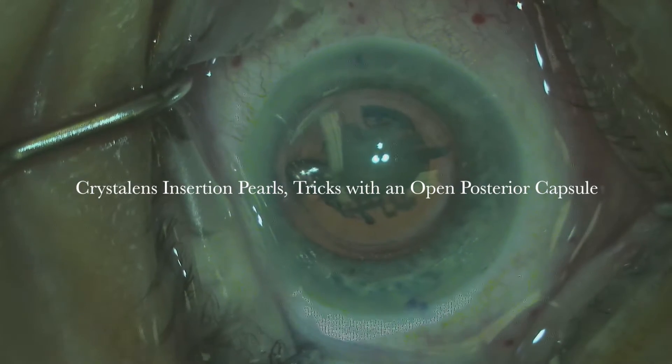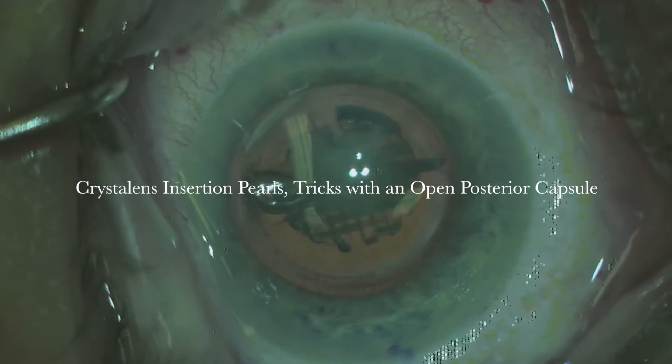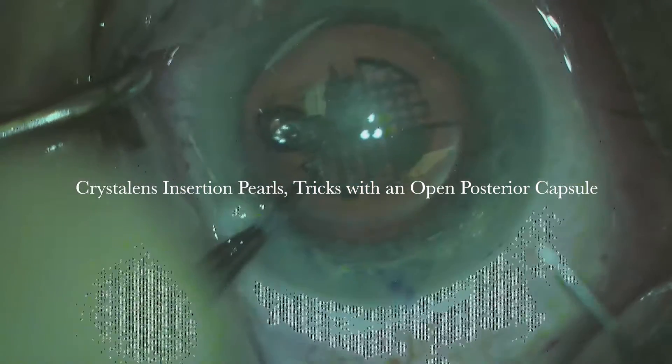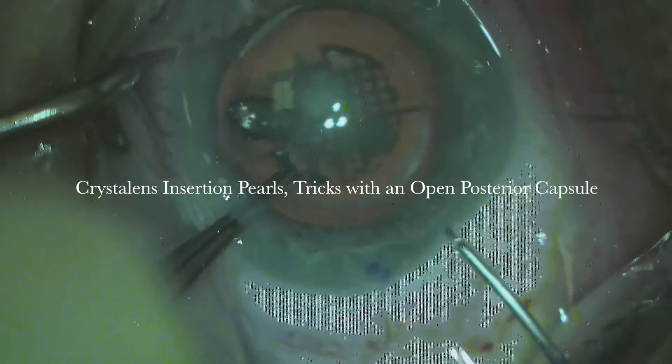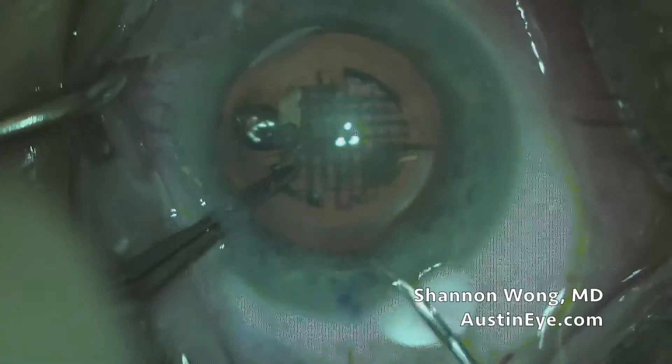Hi, this is Dr. Shannon Wong in Austin, Texas. I'm going to present some Crystalens IOL Insertion Pearls and Tricks in the presence of an open posterior capsule. It's a femtosecond laser guided cataract surgery procedure.